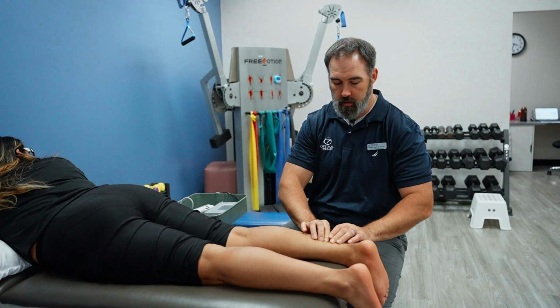What that does is that transfers energy into the tissue. It can increase blood flow, it can break up calcifications, it promotes the healing process, it increases inflammatory chemicals in the area that help to remodel tissue.